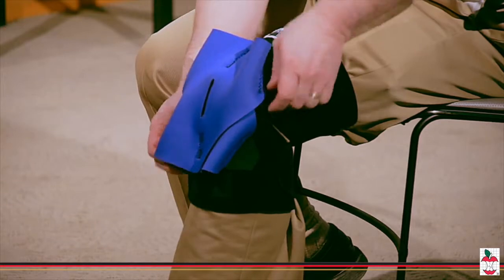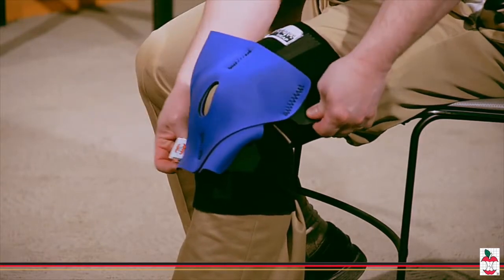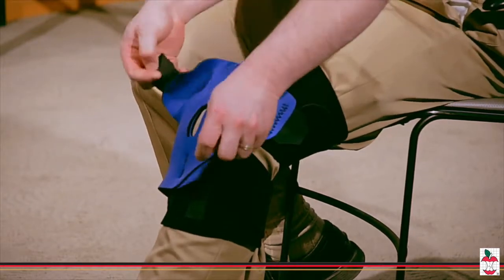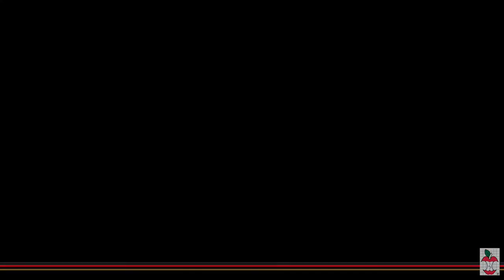The unique four-way tensioning system provides a custom fit for a multitude of knee problems, including patellar subluxation, degenerative knees, infrapatellar tendonitis, jumper's knee, and meniscal pain.